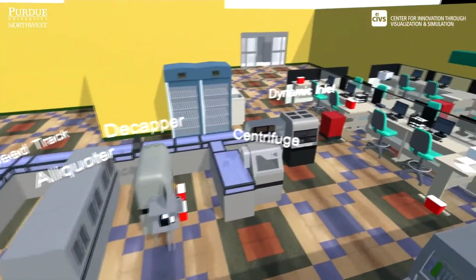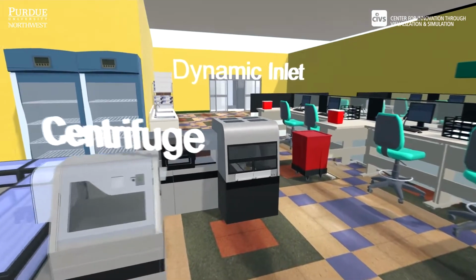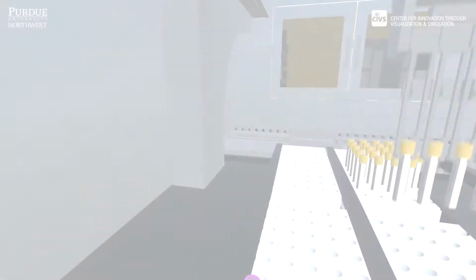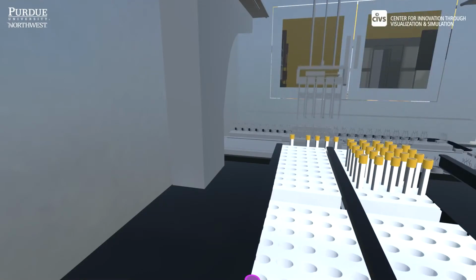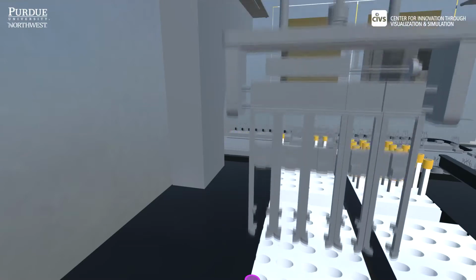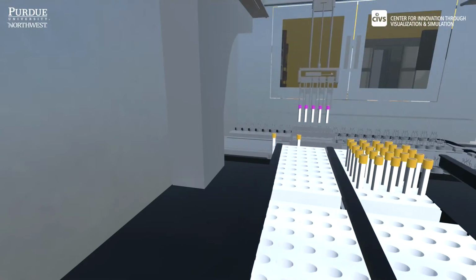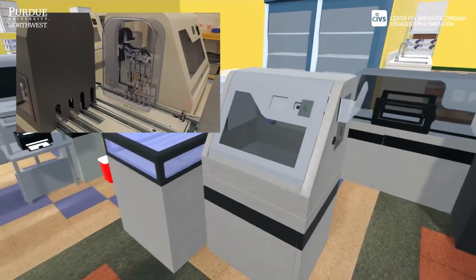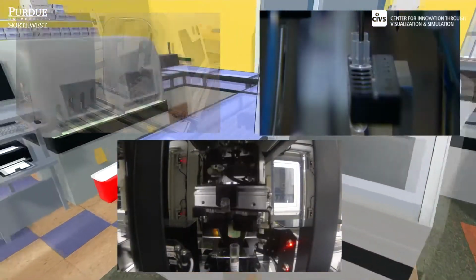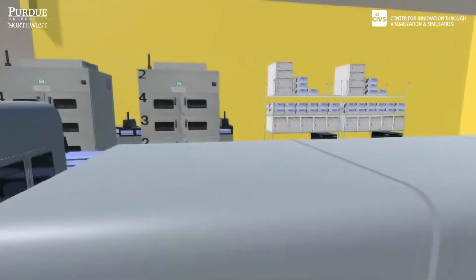Alverno serves several thousands of patients each and every day. Patient care is our top priority. The specimen enters the automated line, the Beckman Power Express. It is a state-of-the-art automation line that can handle 1,200 tubes an hour. It receives the sample in the laboratory information system, centrifuges the sample, aliquots the sample, and routes the sample to the appropriate analyzer for testing.